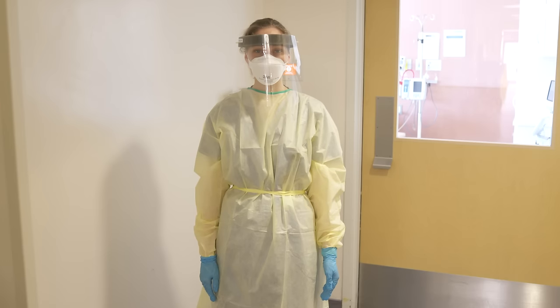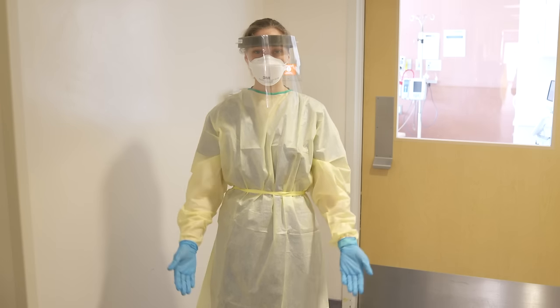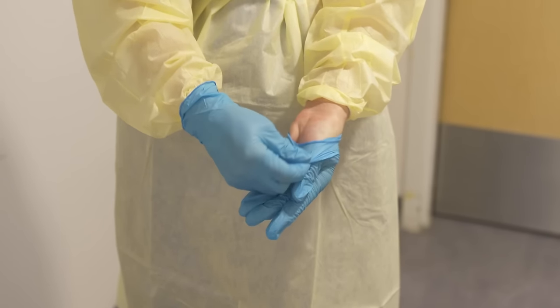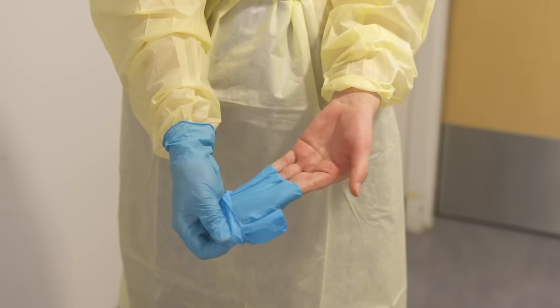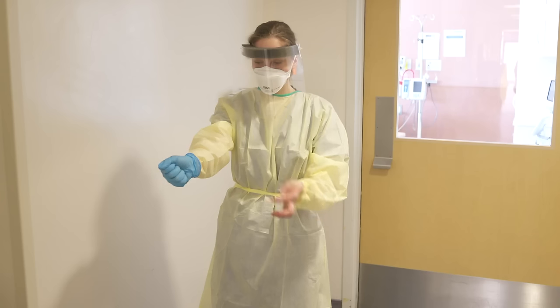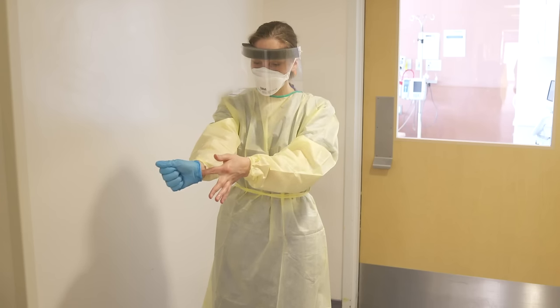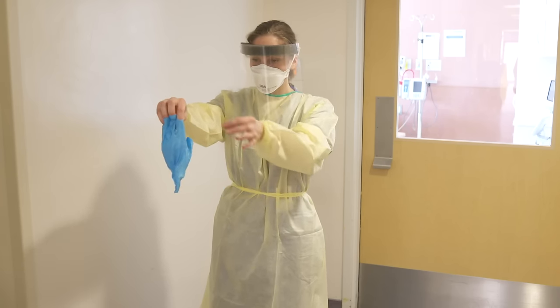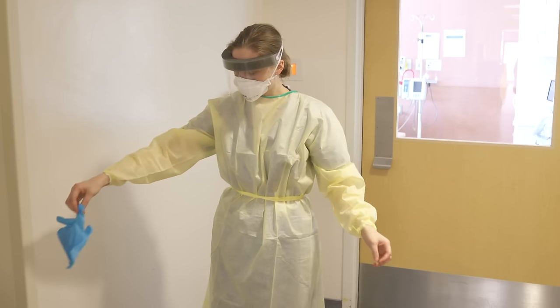When doffing your PPE, step into the anteroom, ensuring the door is closed behind you. Remove the first glove by pulling it up and away from the middle of your palm, ensuring no skin contact. Hold the glove in the other hand. To remove the second glove, place a finger inside the clean area of the glove and push it off, balling up both gloves together. Throw into the garbage.